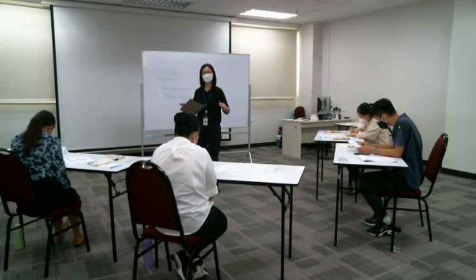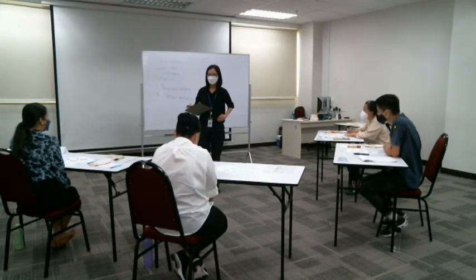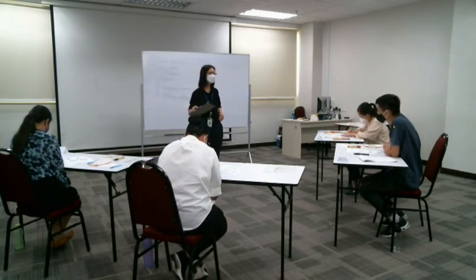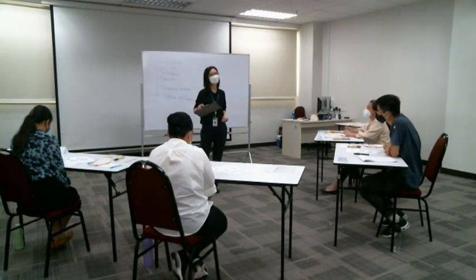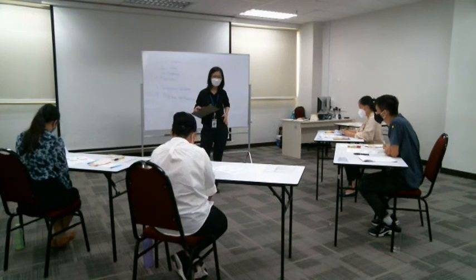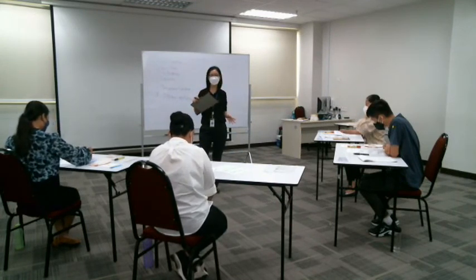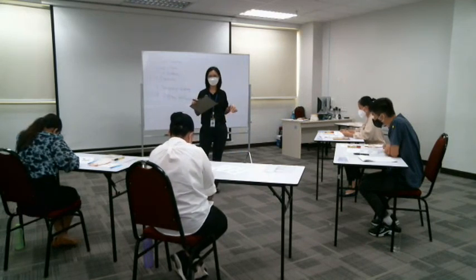Okay, so module 1, we also talk about some common problems. The most common problem for ostomates is peristomal skin problem. So what is the major reason that causes the skin problem? Poor fitting bag. What did you say? Leakage, yes. Leakage can be due to poor fitting bag, so it leaks out, or poor adhesion. If poor adhesive, it cannot seal, cannot stick on the skin properly. So take care of this. You do not want the content to touch the skin. Content is supposed to be inside.